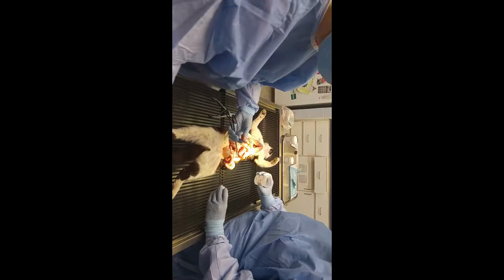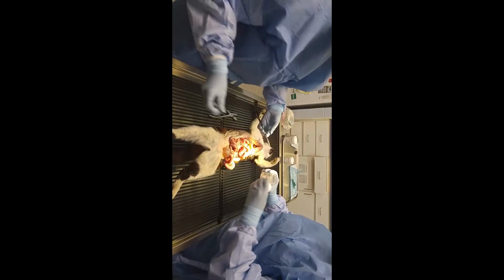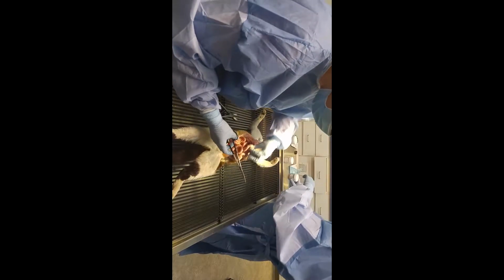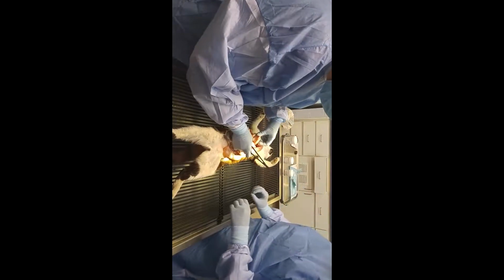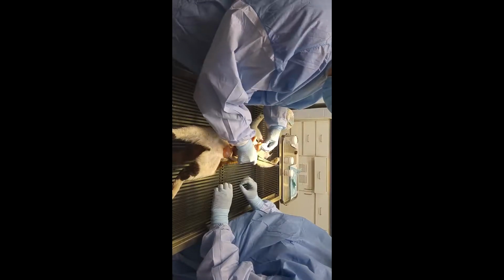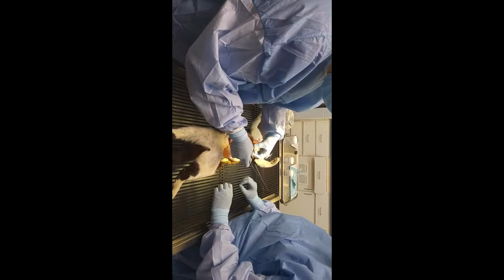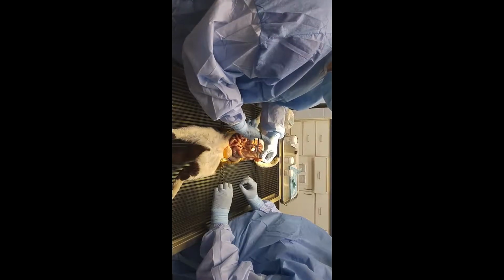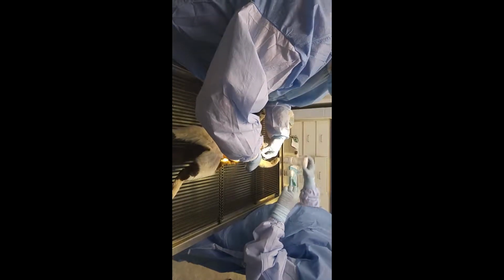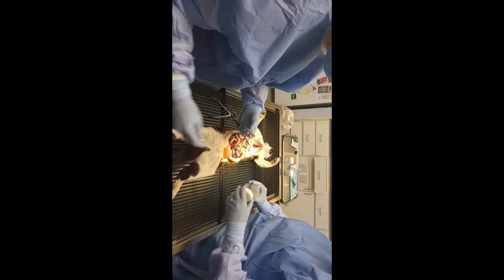And I'm going to use my forceps to drop it into the formalin. And I may just go take another piece of small intestine from further down. So there's the cecum, just working back. We'll get a piece of ileum here, just to have a representative piece from a couple of areas within the intestinal tract.